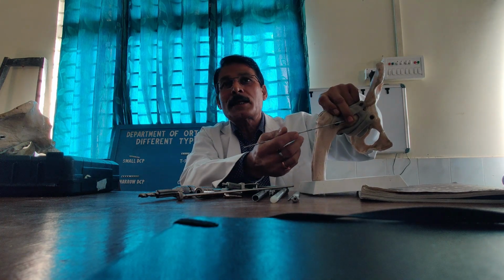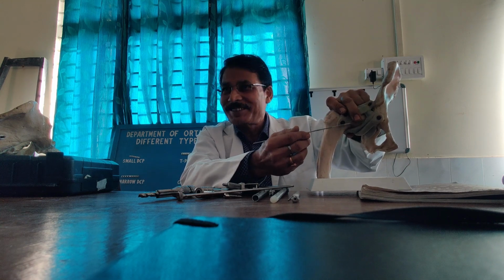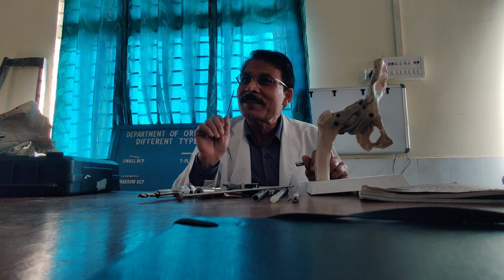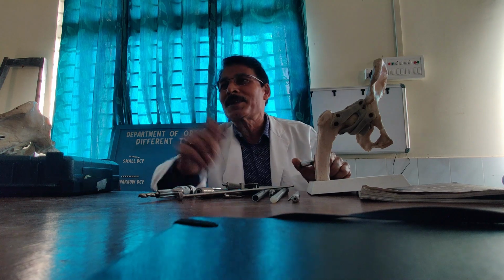So necessarily this angle will not be the same in all persons. They will be very variable. So that is why reverse things are actually more scientific. It means you are trying to put the guide wire in the center of the neck, center of the head, bull's eye. Then you calculate how much angle actually it is. Then select the plate reversely. Ideally. But acceptability is there.